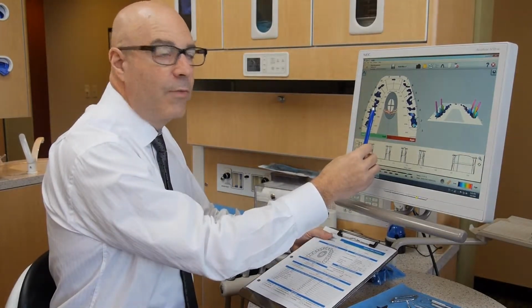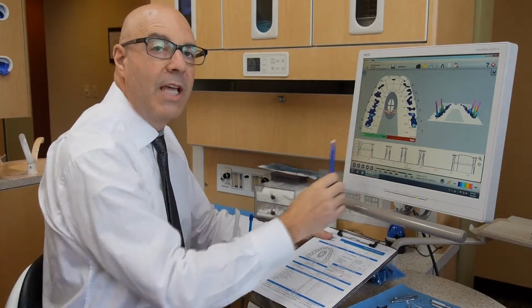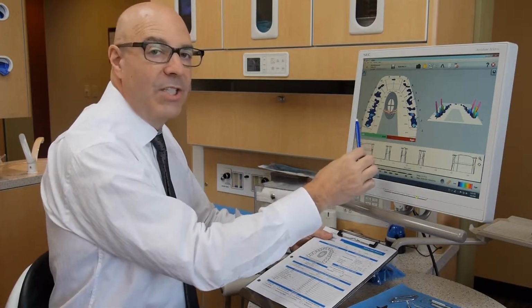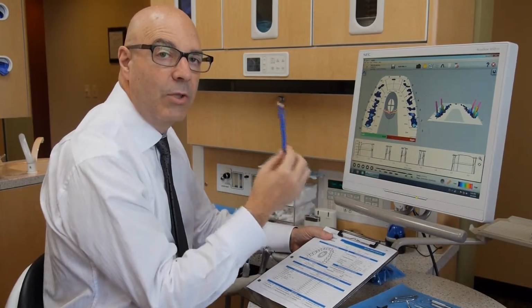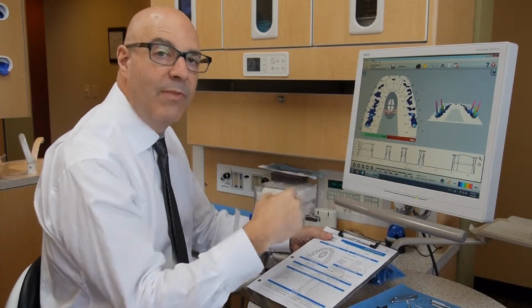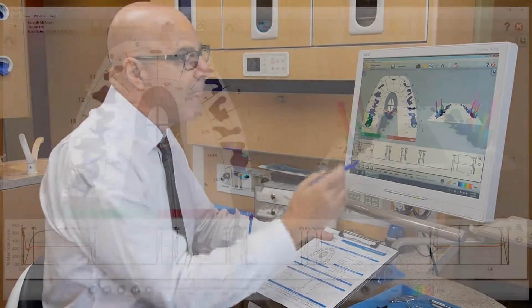If the center of their force is way off to the side, outside of the target zone, that denture will be loose and rocking around. Our patient doesn't have a denture, but that force distribution, which is off target, will send a signal to the headache center in the brain, which then is an abnormal feedback loop signaling dysfunction in this patient.